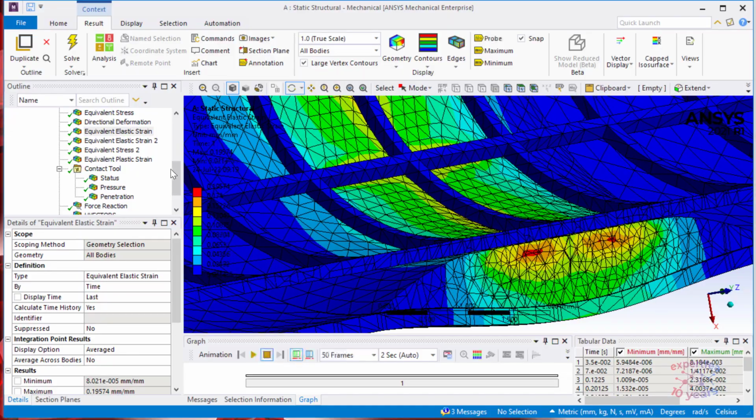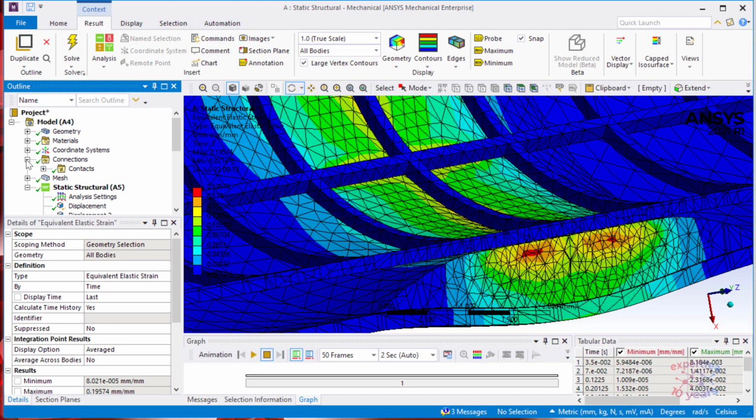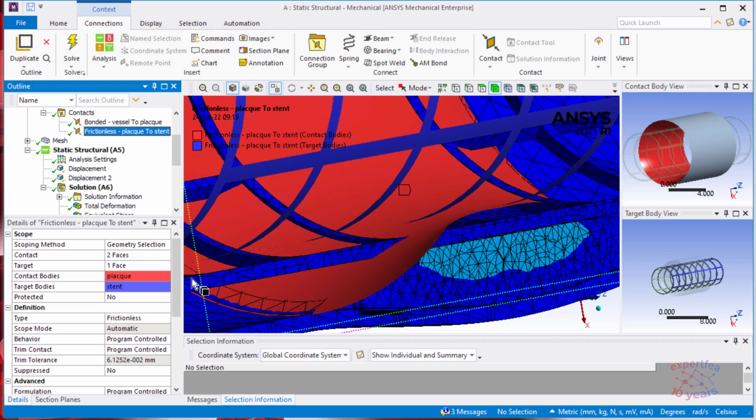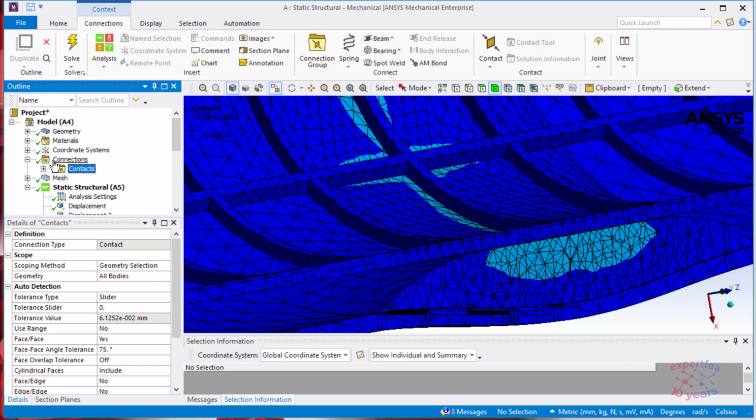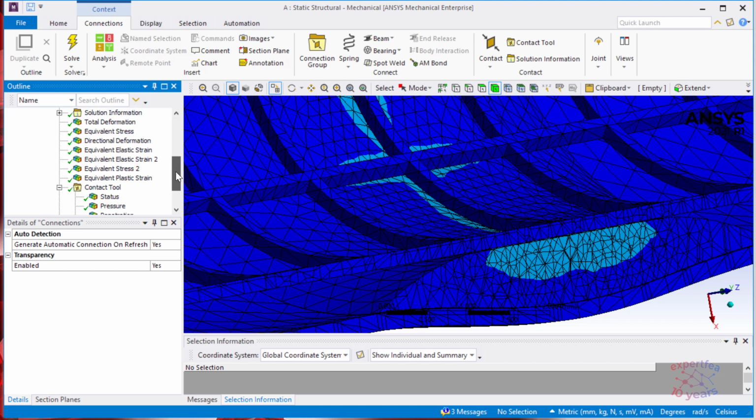Let me remind you, it's very important. Please note down and remember these options. This option, geometry modification interface treatment, just attach, will save you from lots of trouble and will solve everything correctly in most cases. We've seen stress, strain, everything.